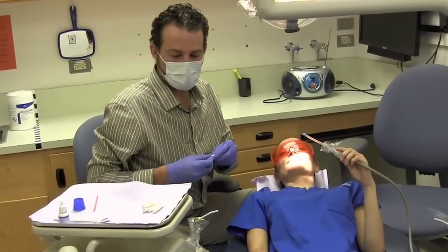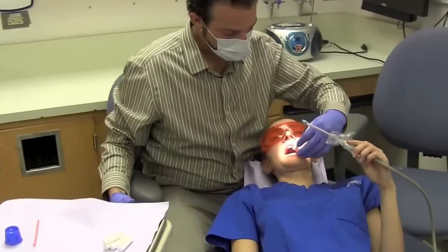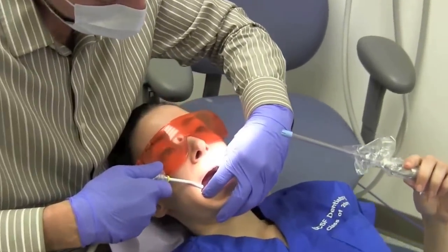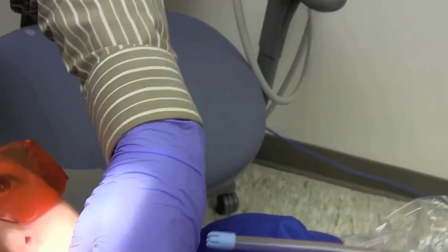We're going to take some cotton and isolate the area. We're going to be applying on to number 30, occlusal, first permanent molar. We have our air water syringe.